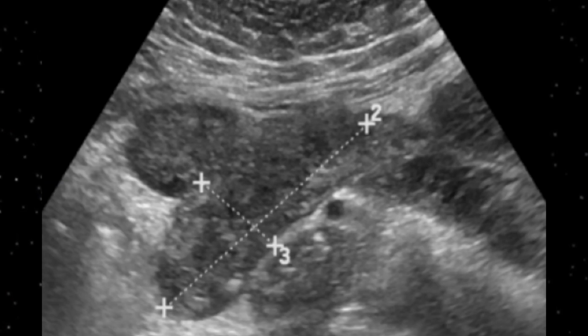For better understanding, a close view has been shown on this slide, and the measurement has also been given. So look for the diameter, look for the dilatation, and look for the length, to what extent this thrombus has occupied the ovarian vein. So this is again ovarian vein thrombosis, which is quite easy to pick on ultrasound imaging.